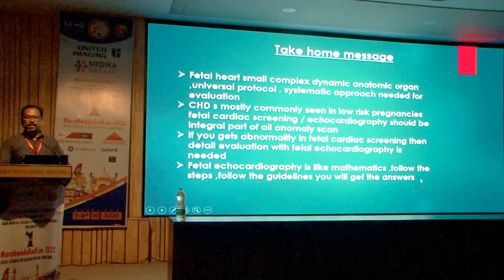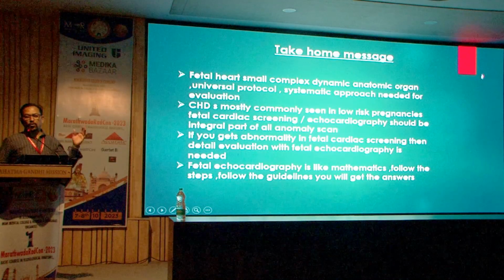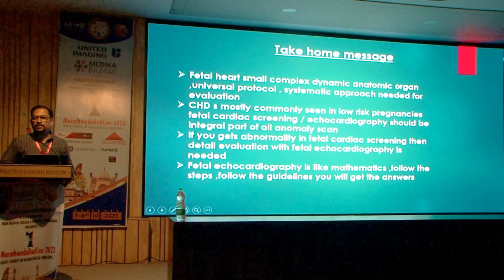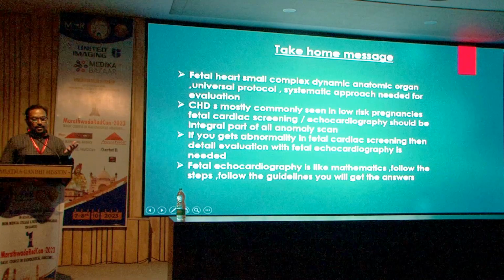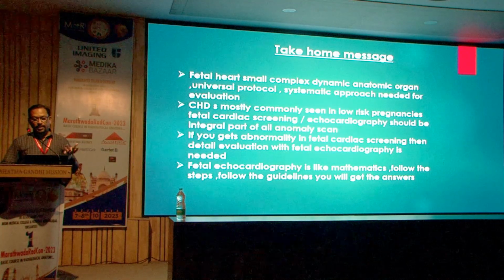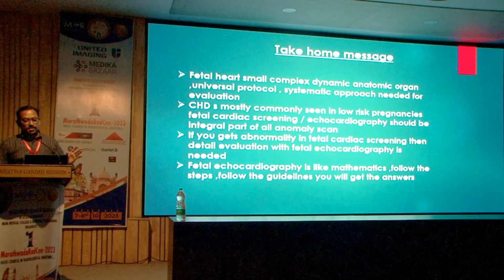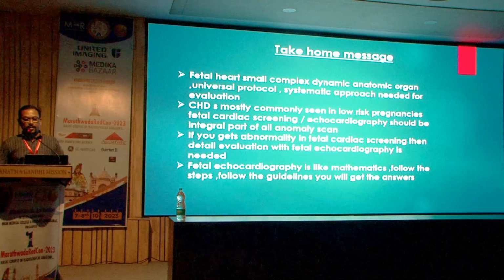So to conclude, the fetal heart is a small, complex, dynamic anatomic organ. One has to follow the universal protocol guideline for the evaluation of the heart. CHDs are most commonly seen in low risk pregnancy. So basic fetal cardiac screening should be an integral part of all anomaly scans. If you get an abnormality in fetal cardiac screening, then extend the evaluation with fetal echocardiography. And fetal echocardiography is like mathematics. Follow the steps, follow the guideline, you will get the answer.